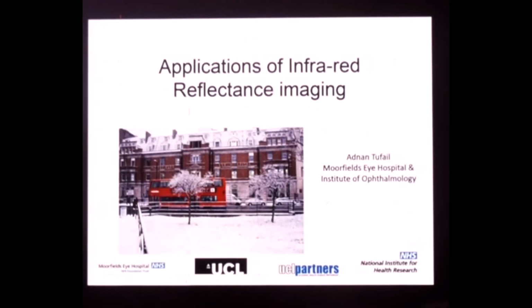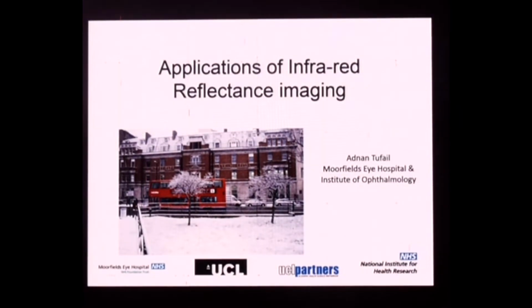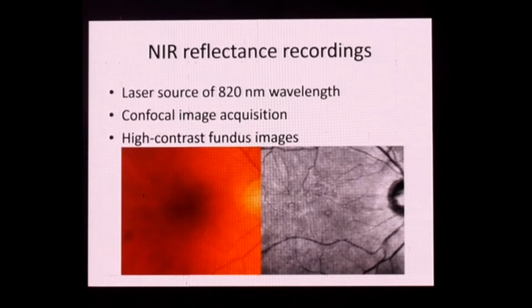Thank you. So I'm going to give a hopefully succinct talk on application of infrared reflectance images, and I've changed a few slides just to be slightly controversial about some of the previous talks today.